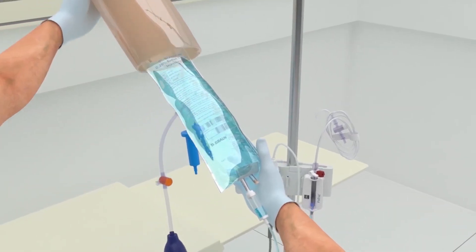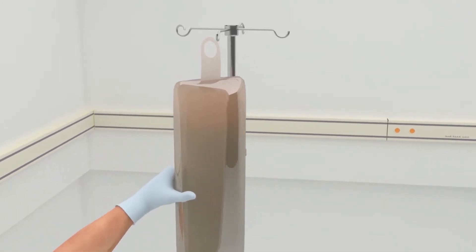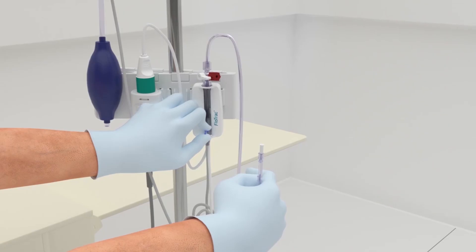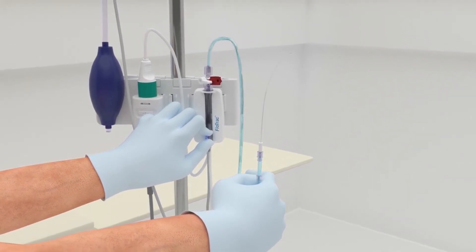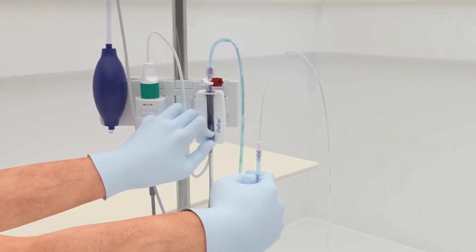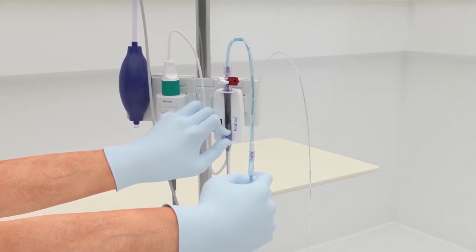Insert the fluid bag into the pressure bag and hang on the IV pole. Do not inflate — with gravity only, no pressure in the bag. Flush the FlowTrack sensor, holding the pressure tubing in an upright position until the column of fluid reaches the end of the tubing.